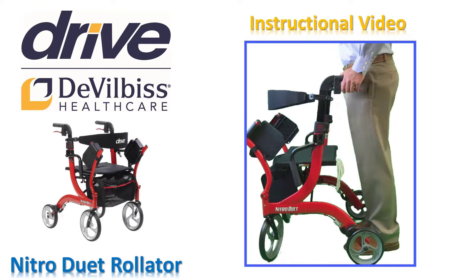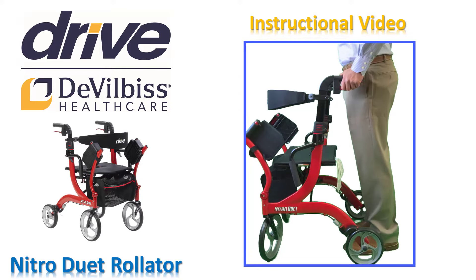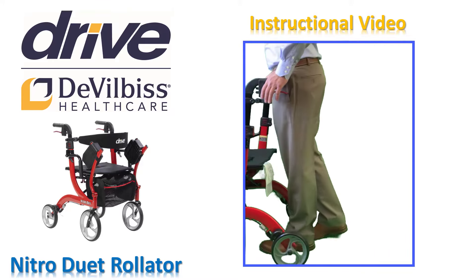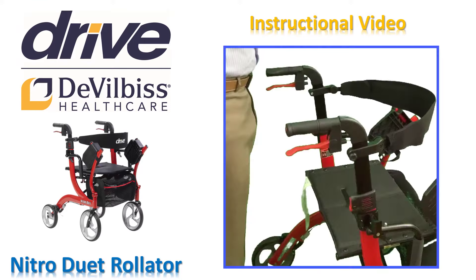Before we make the adjustments to the backrest support, let's review the brakes. When you are walking and you want to slow or stop, pull up on the red handles by squeezing your hand until you stop. Always brake slowly and steadily. When you release your squeeze, you will be ready to move again. When you are going to park your rollator or sit on your Nitro Duet, you need to put the parking brake on. Before you ever sit down, you must put the brakes in parked position so the rollator does not move while you are trying to sit down.